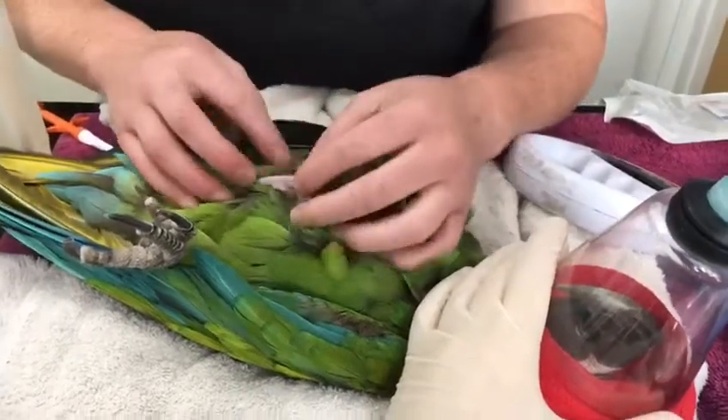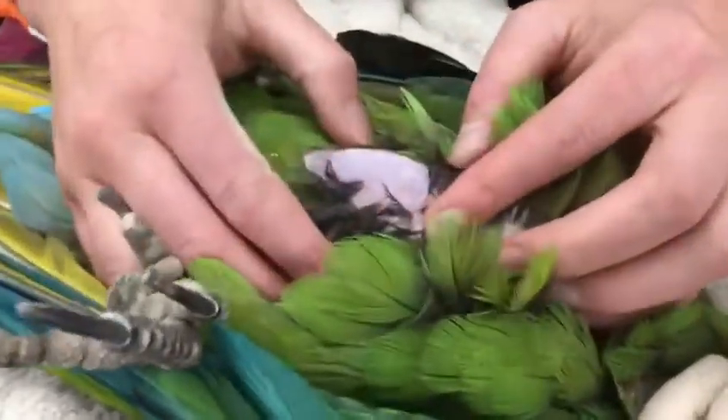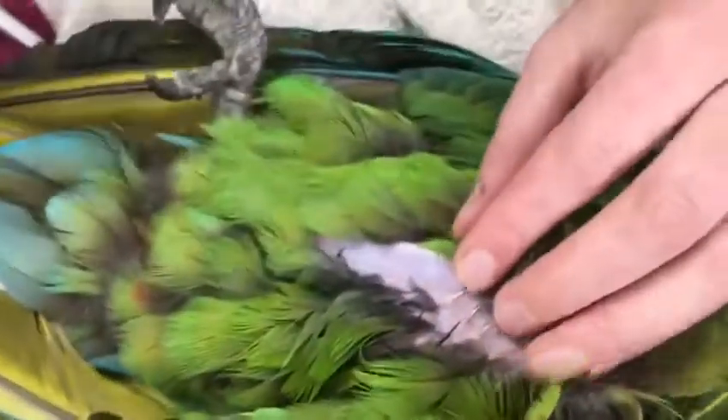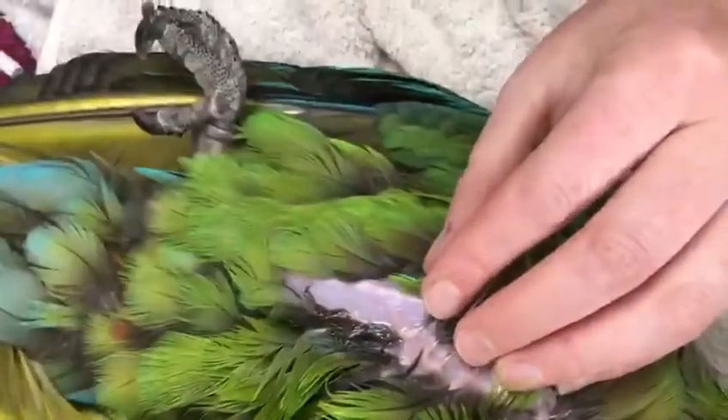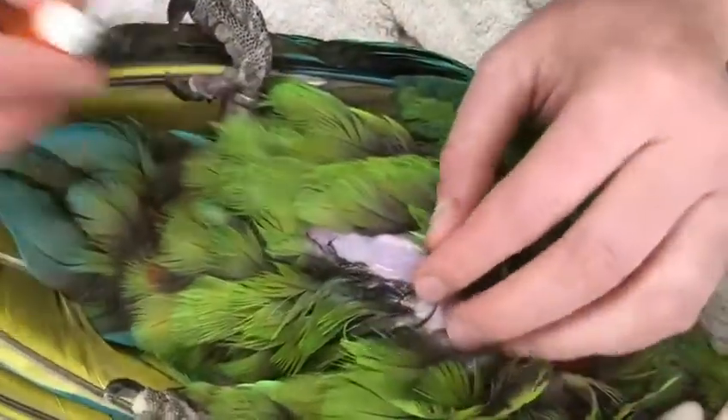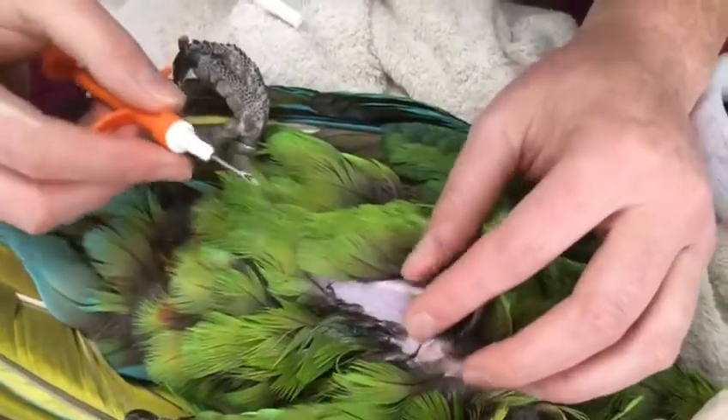If you want to part the feathers, you're aiming to put the microchip on the left breast in the middle third of the muscle. Place a tiny little bit of surgical spirit on the site and have your microchip ready. We'll have already scanned the patient to make sure there's not a chip already placed.